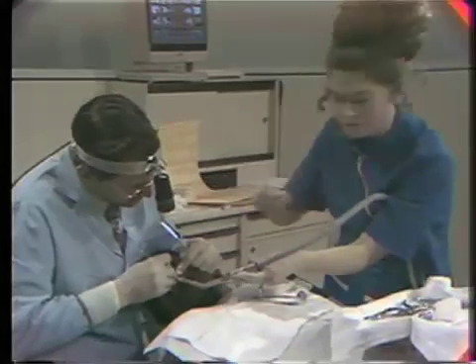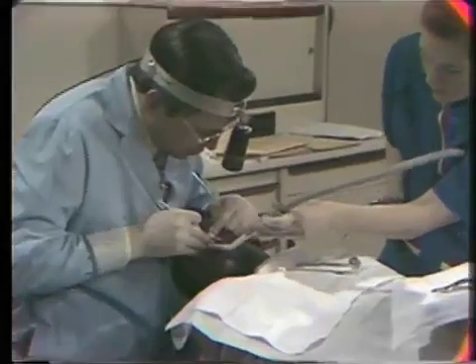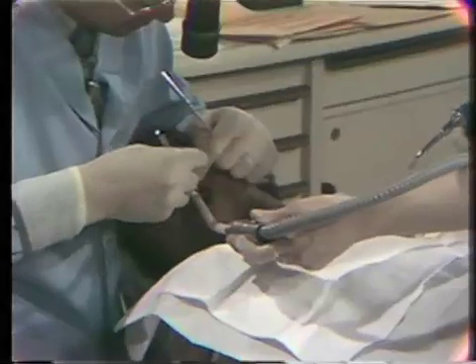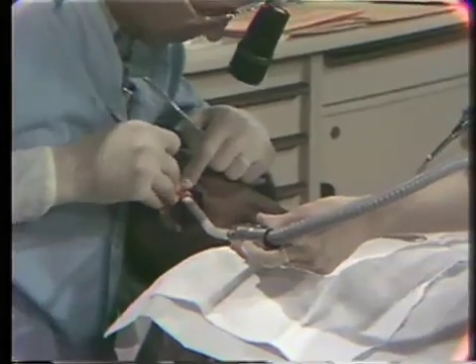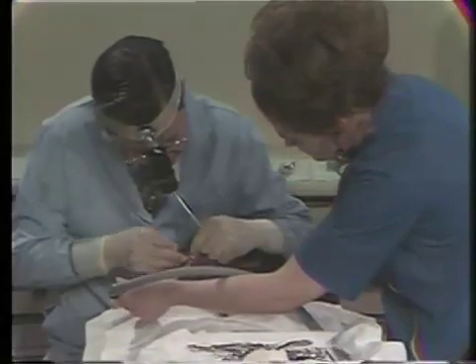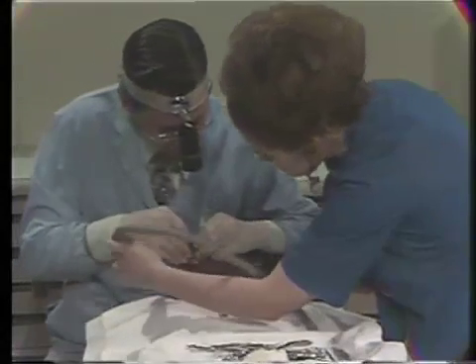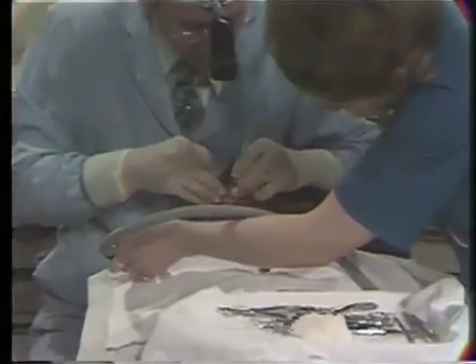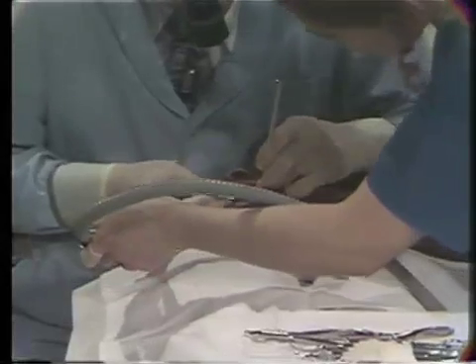One thing I like to emphasize in talking about periodontal surgery and doing gingival surgery is that one of the most important aspects of this operation is to gain direct access and visualization of the root surfaces, so that they may be very meticulously cleaned and made as smooth as we possibly can get them, to increase the potential for healing and new attachment around the teeth, and hopefully at a more coronal level.